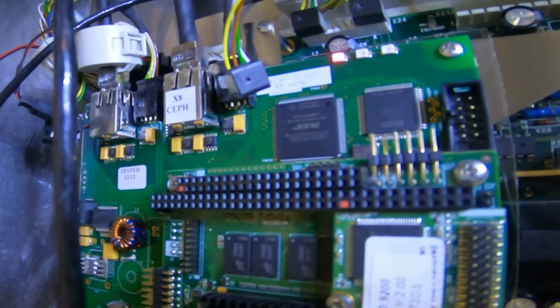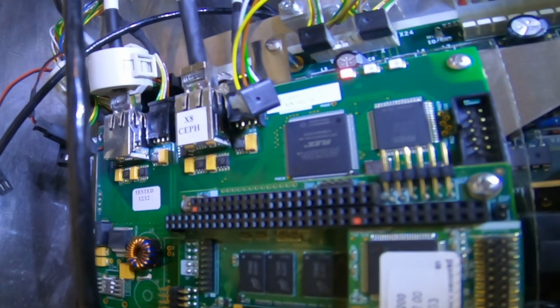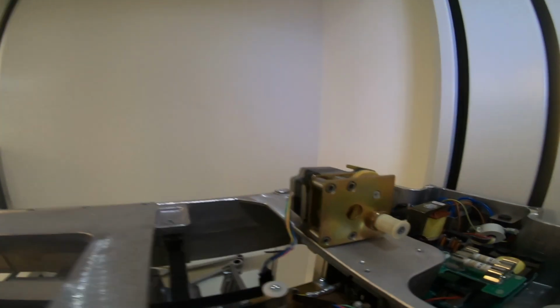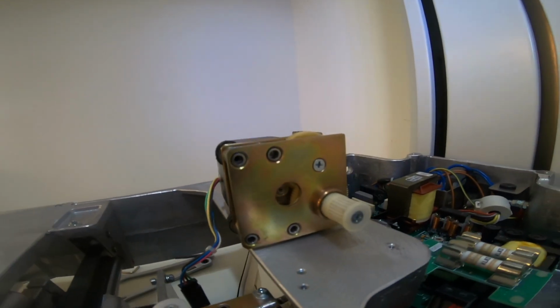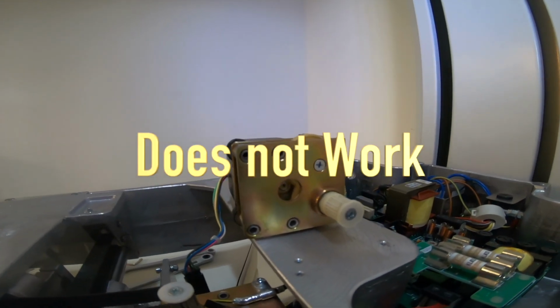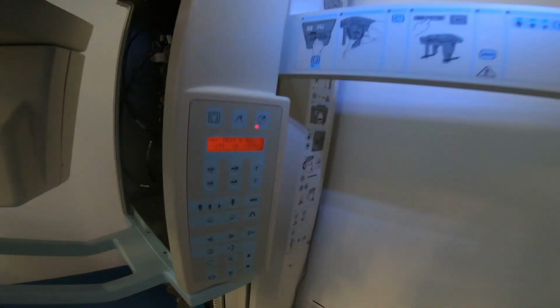And I put it on the first 4 pins, which is the Y connector. So in this first take, I'm using the R cable attached to the Y pins, and that does not work. Really not working. Does not work.